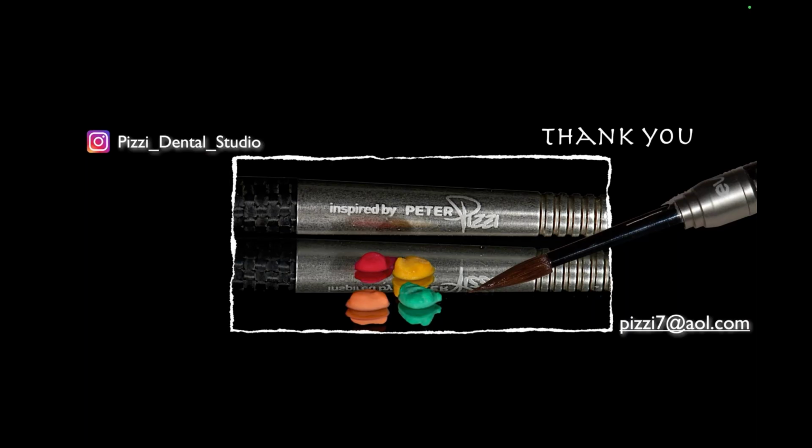So I'll say this, it sounds self-serving, but I don't mean it that way. Our key to our future still has a lot to do with understanding materials, layering, micro-layering, and I get how much monolithics are taking over, and I use them just like you guys do. But I can't stress enough that the future of your businesses has to do with your knowledge of what, where, and when to use it.